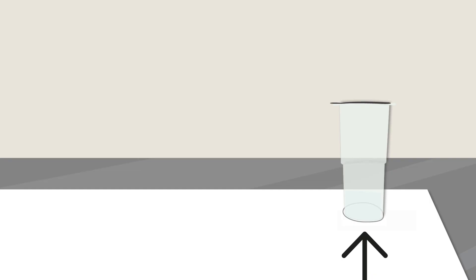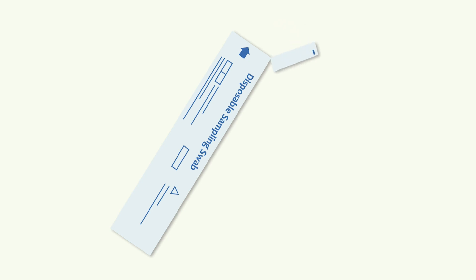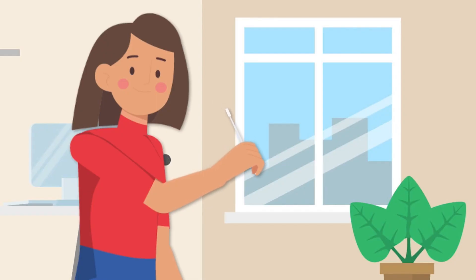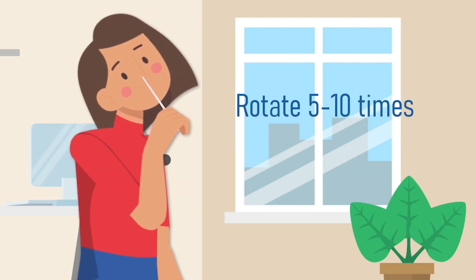You are ready. Remove the cover of the extraction buffer tube and place the tube in the tube holder on the box. Take the swab and be careful not to touch the soft part. Introduce it carefully into one of your nostrils, no less than two centimeters. Roll the swab for about five to ten times inside your nostril to ensure that mucus and cells are collected.